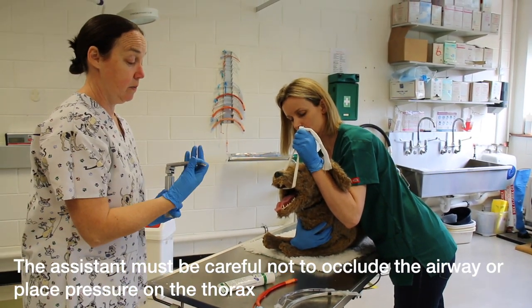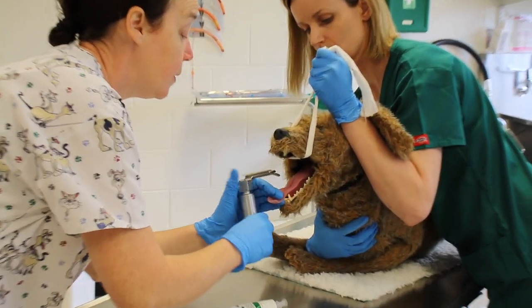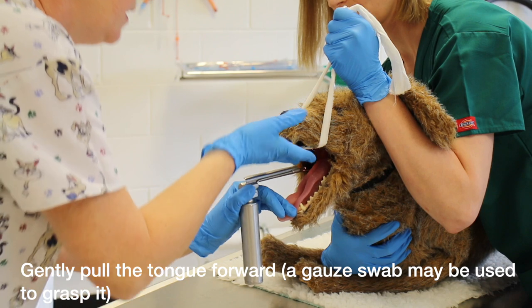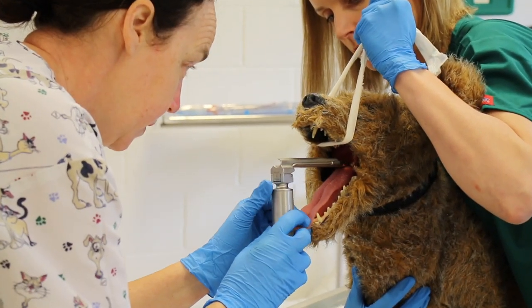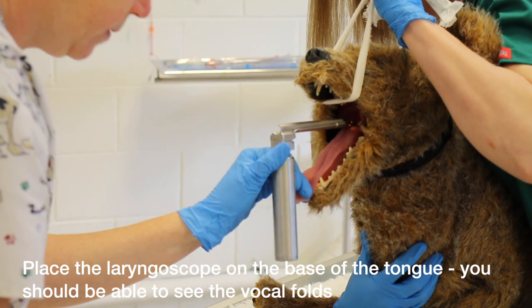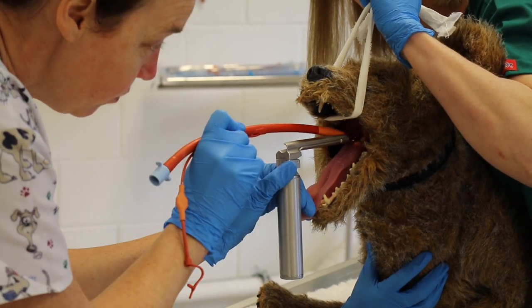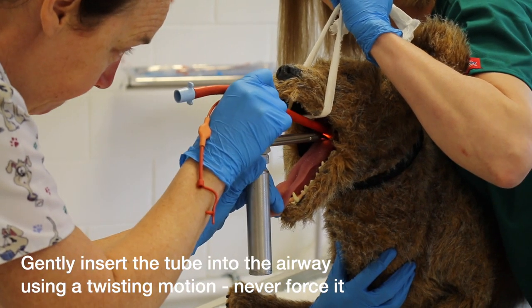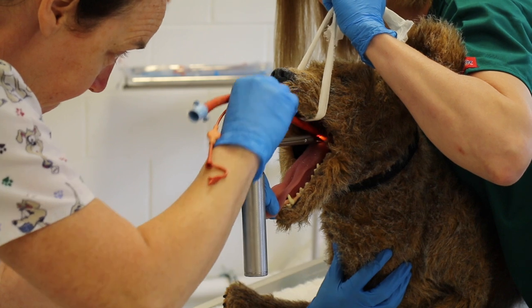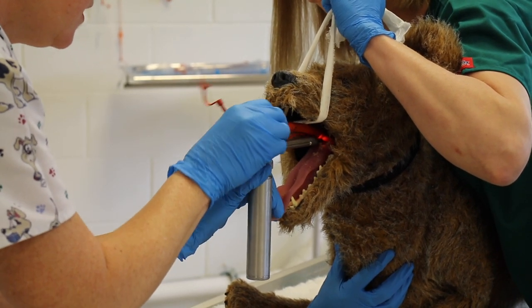We pull our tongue forward and hold it with our fingers. We use the laryngoscope on the back of the tongue so we can visualise where our tube is going to go. We then run our ET tube down the blade of the laryngoscope and into our patient.